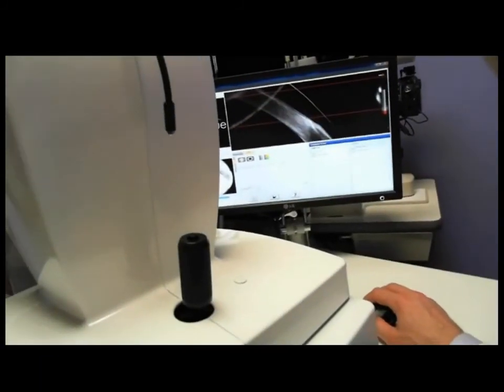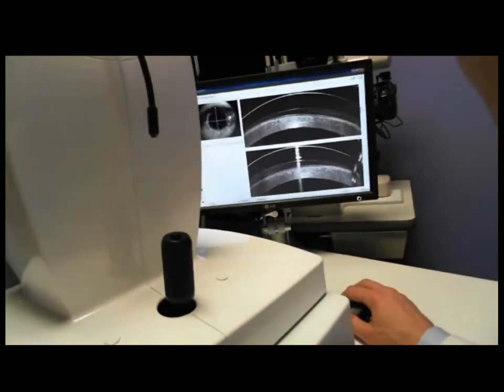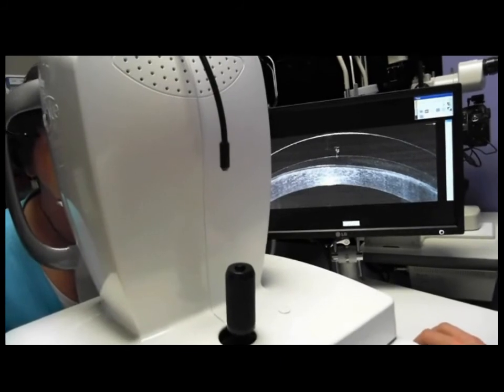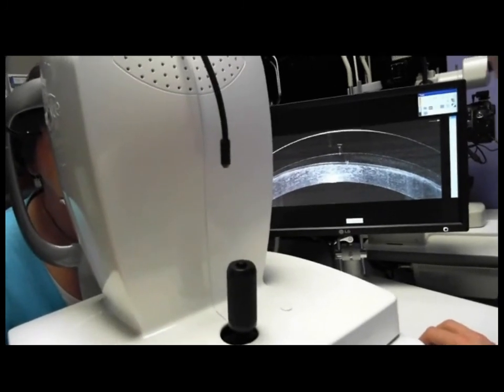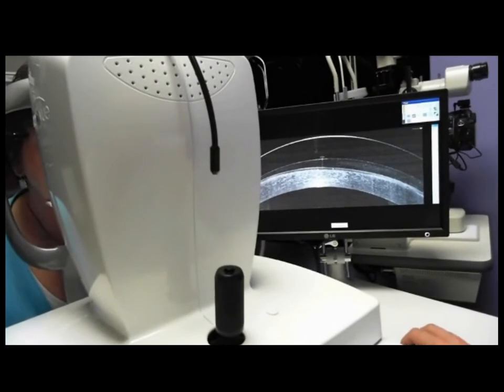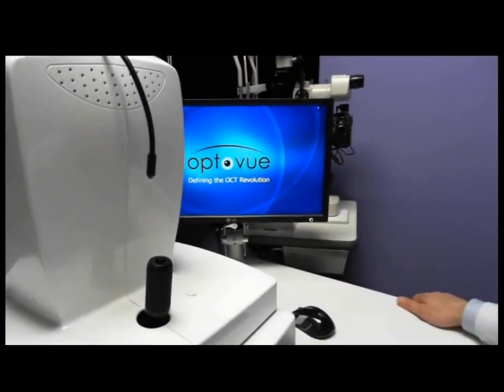Now, the other thing that we can do with OCT is measure the exact amount of vault. So let's take a look at this left eye. And we'll put our caliper tool here. And we'll get this right about in the center part of the cornea, which is right about here. And we can see we have 225 microns of vault, which is great. All right, we're in good shape here.